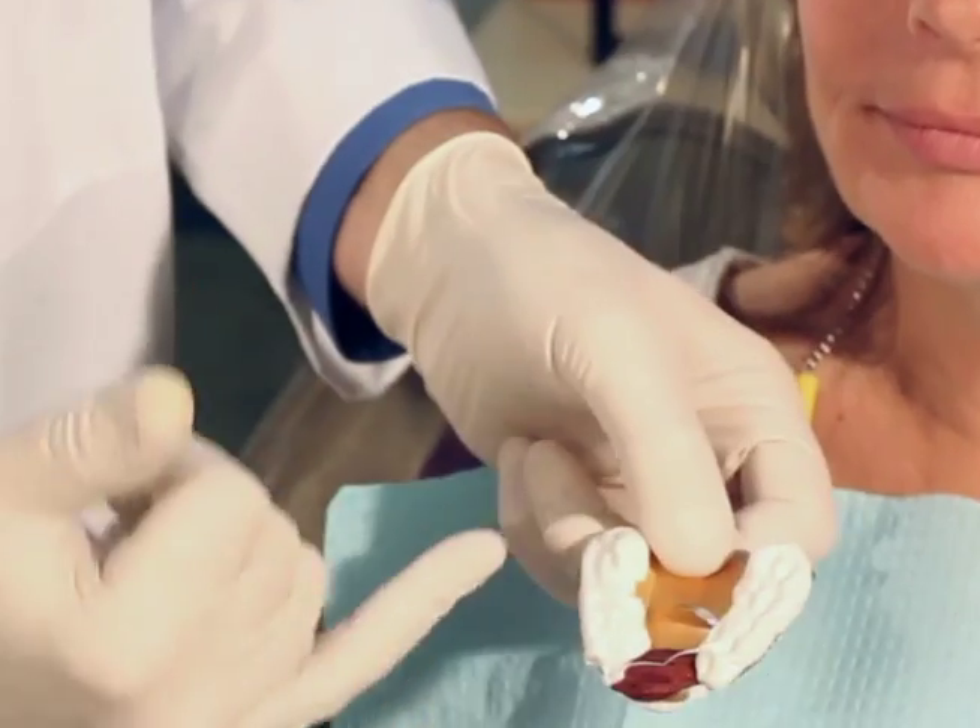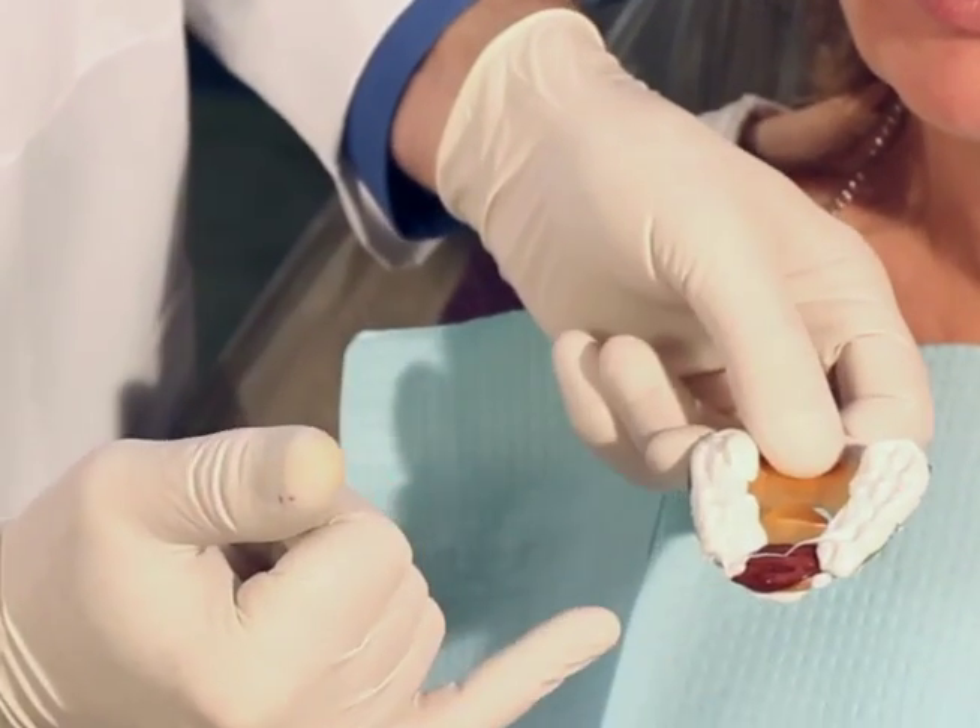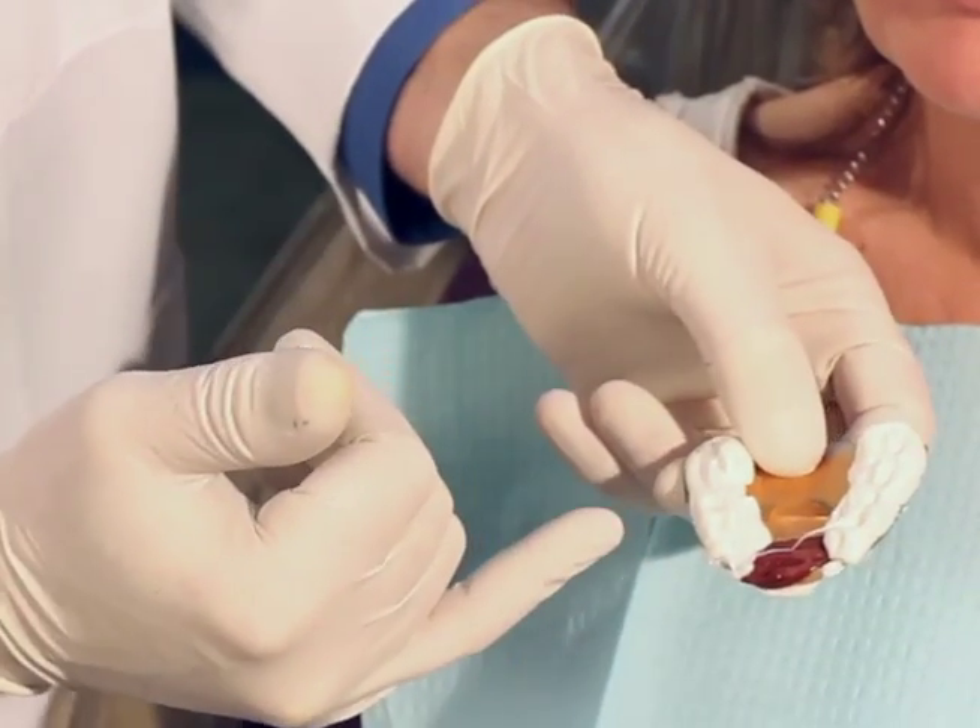We can see that we do have indentations of the posterior teeth for programming our protrusive pathway into the articulator when we get to the laboratory.